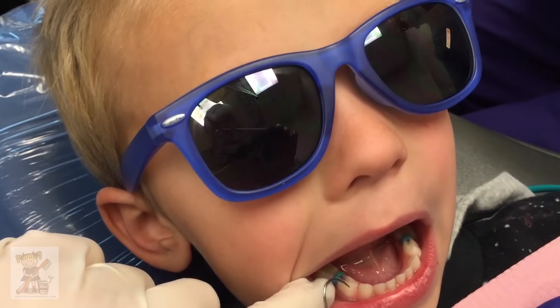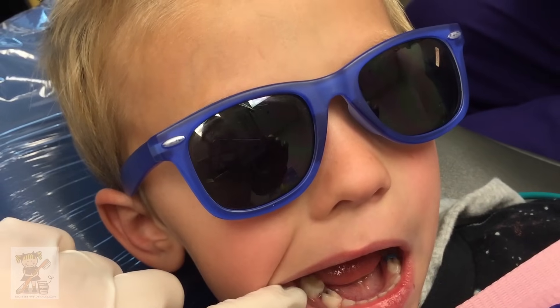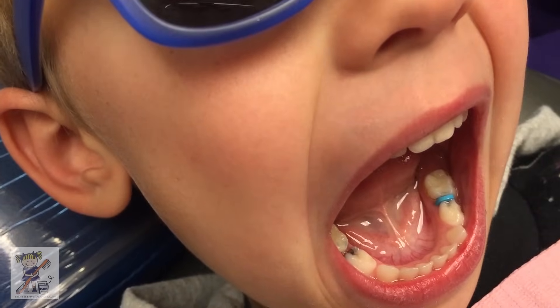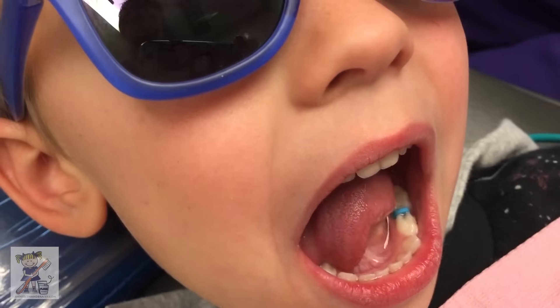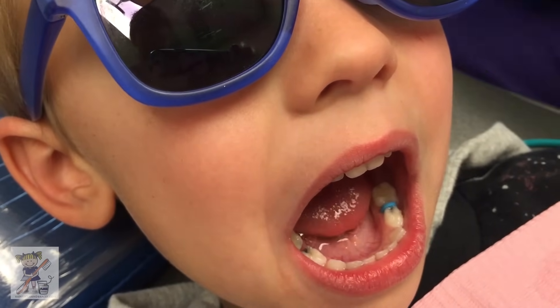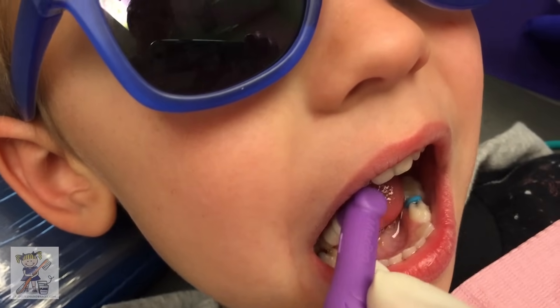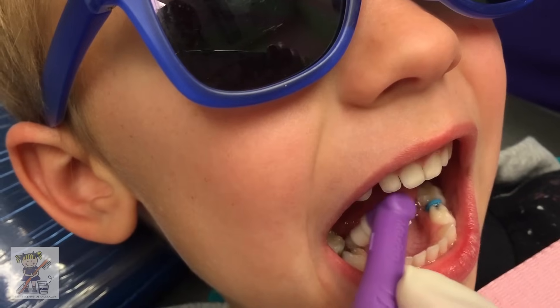Can you open really big, honey? So he had some primate space so we didn't need one on the mesial. Take that out. So see how there's this little space between his teeth? Perfecto. And then we're going to get it nice and clean. We'll pumice it — plain pumice. Brush it out. Good boy.